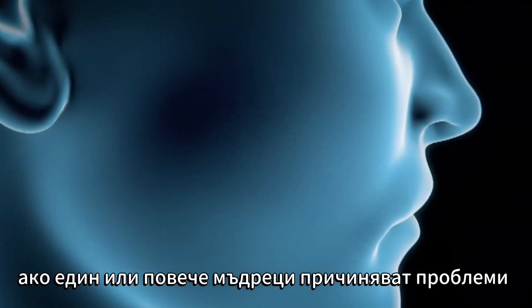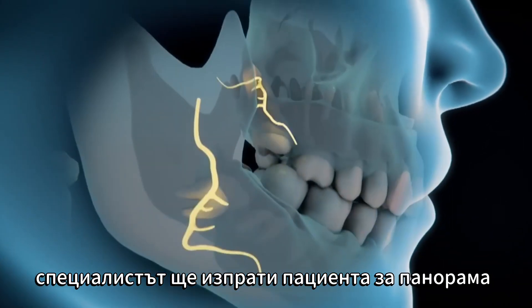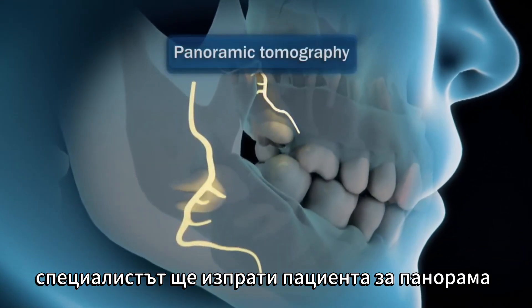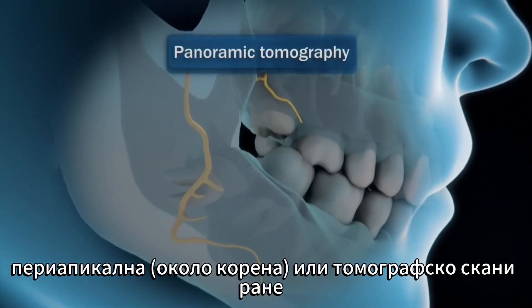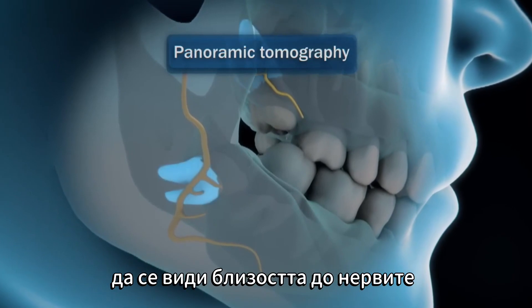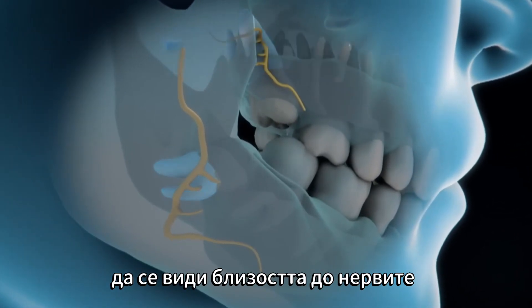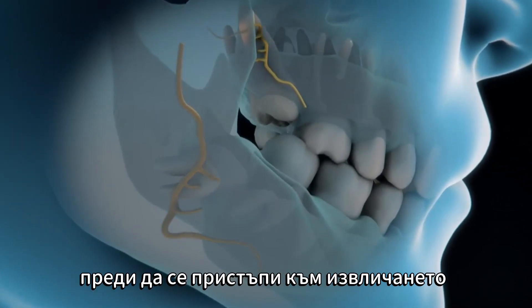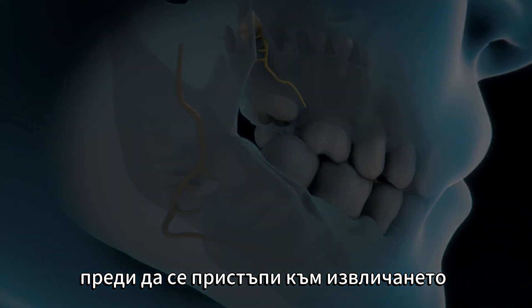If one or more wisdom teeth cause problems, the specialist will send the patient for a panoramic, periapical or tomography x-ray to see the proximity to the nerve, size and arrangement of the roots before proceeding with the extraction.